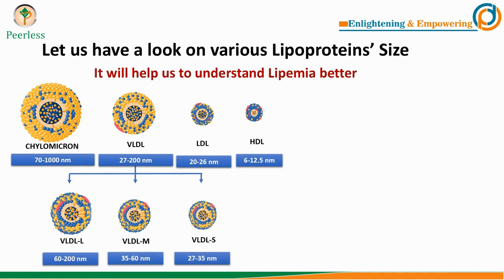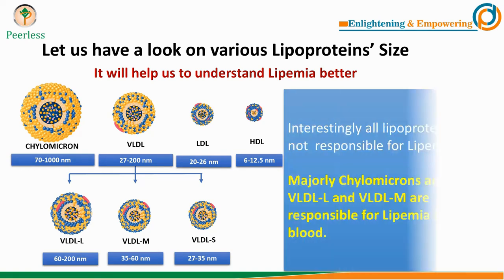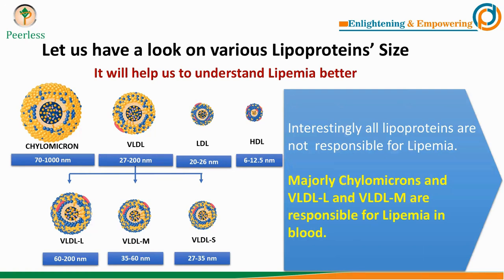There are various lipoprotein particles in our blood, such as chylomicrons, VLDL, LDL, HDL, large-sized VLDL, medium-sized VLDL, and small-sized VLDL. Interestingly, not all of these lipoproteins are responsible for lipemia. Majorly, chylomicrons and large-sized and medium-sized VLDL are the ones responsible for lipemia in our blood.